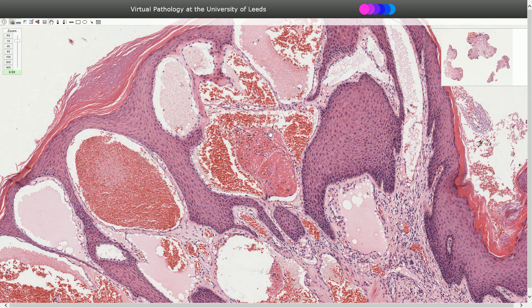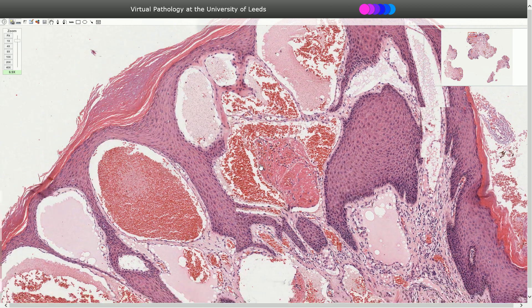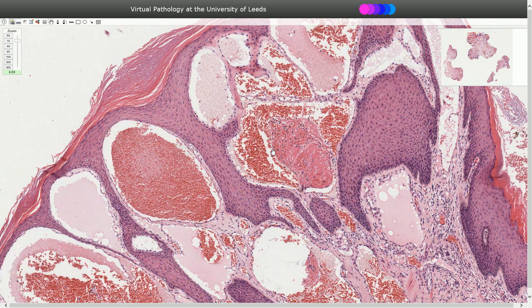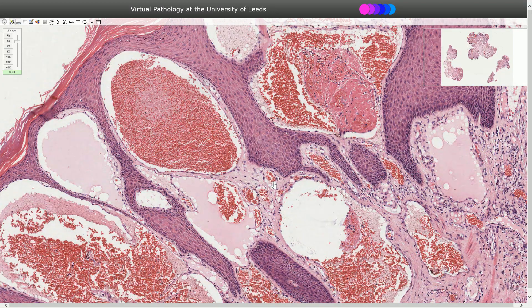Endothelial cells are bland without any atypia and they look quite normal. Some cases of angiokeratomas can be associated with intravascular papillary endothelial hyperplasia, or so-called Masson tumors, but that is not what we see here.